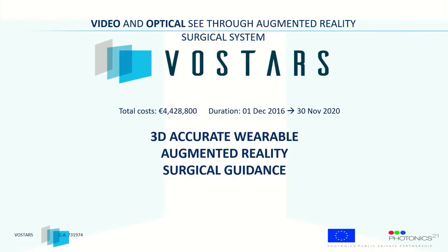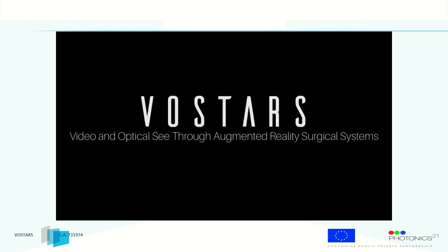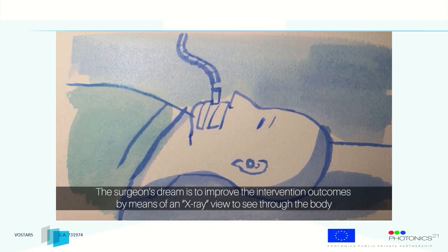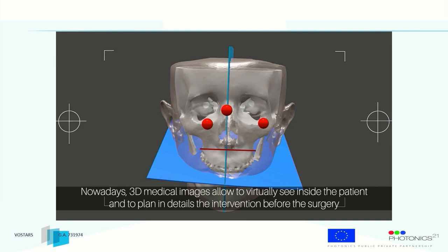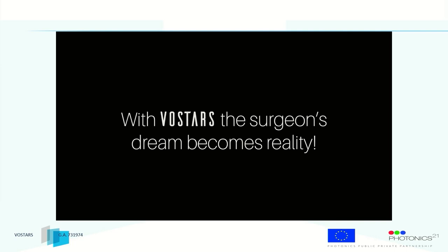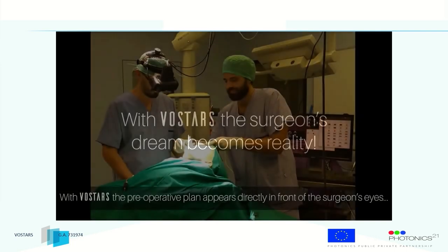Taking into account pros and cons of both approaches, some years ago we implemented a system, but as you okay, I can show you this video. So, as I told before, given medical images, the surgeon can virtually see inside the anatomy in the image, and he can plan the intervention. And with the prototype, with the idea that we already developed, we can merge pros and cons of the two kinds of displays.